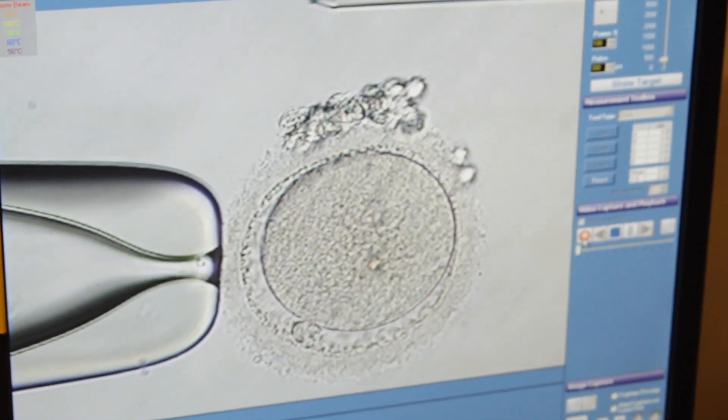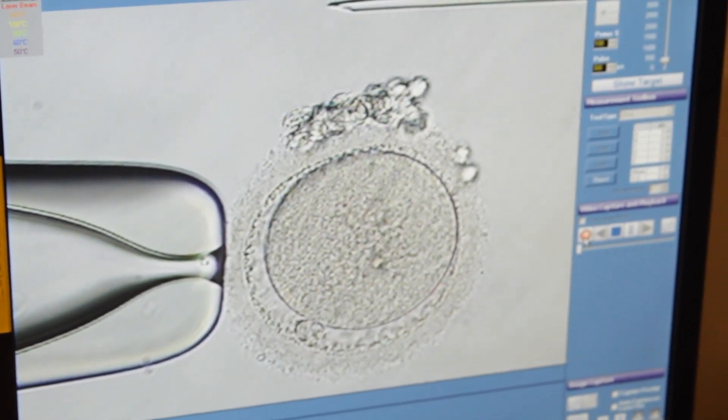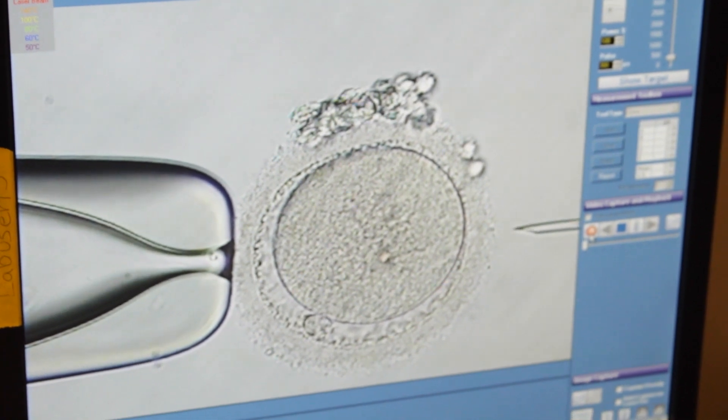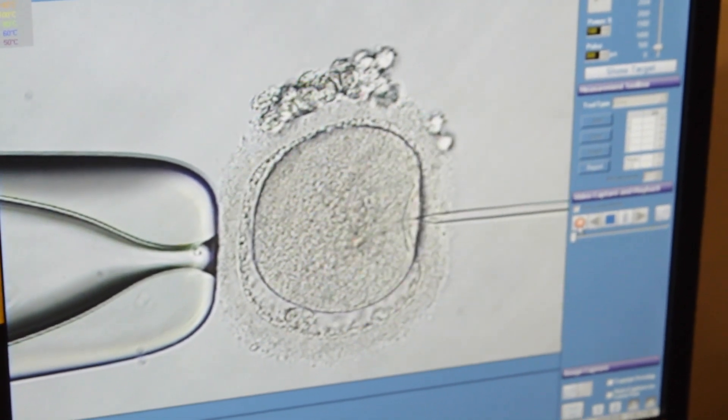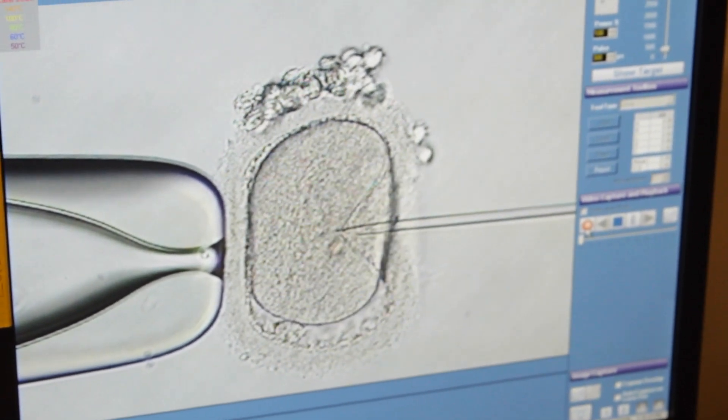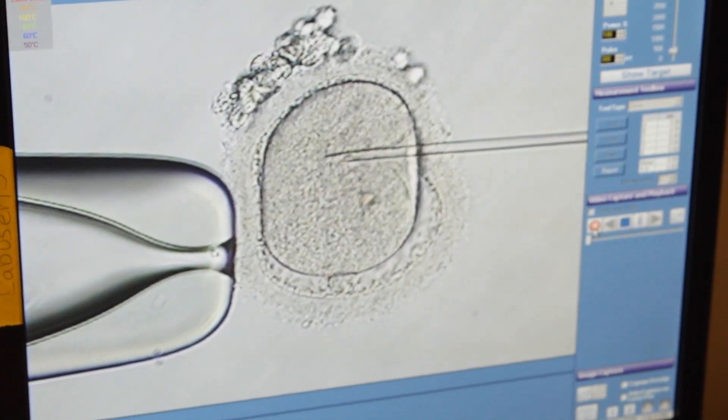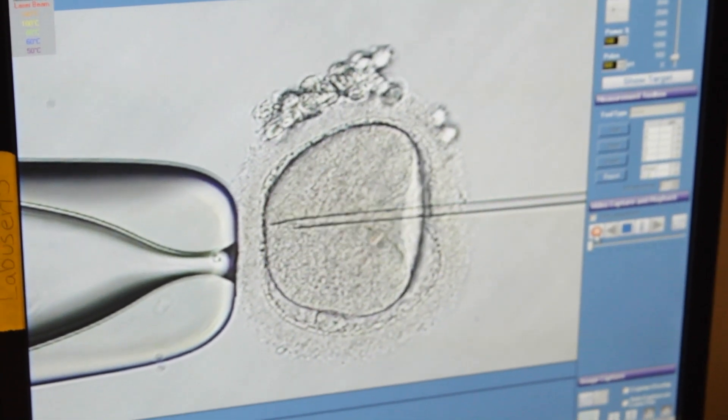Now Donna is bringing the sperm down to the very tip of the injection pipette. The idea is that we want to have no extra PVP injected into the egg.